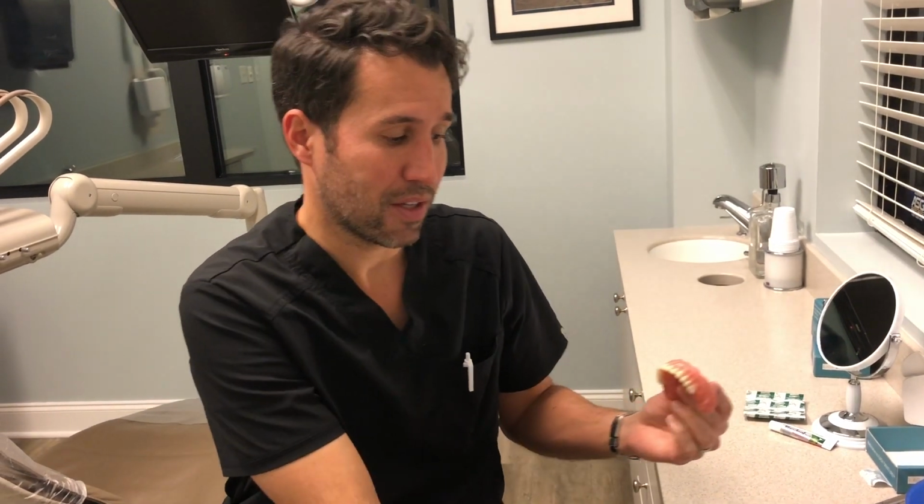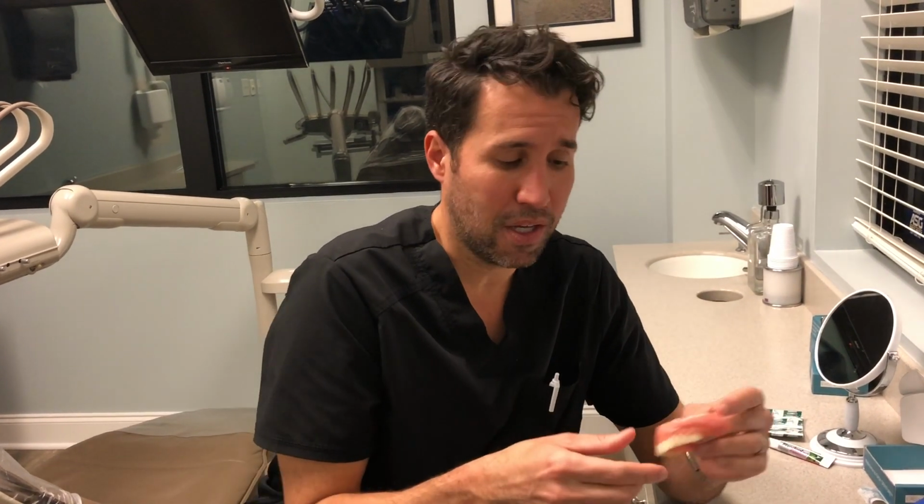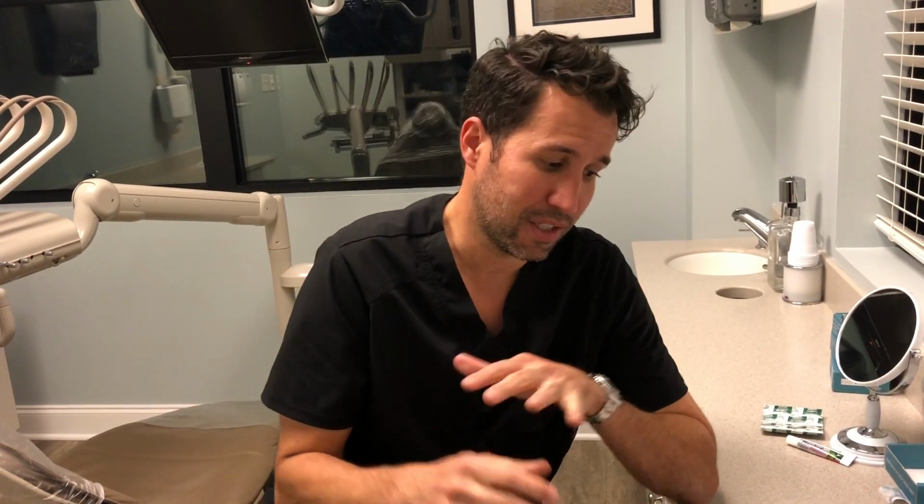Oftentimes I'll do this in my practice and have patients have these as a great backup. Or if they have a lab repair, it's just great to have in our practice as an immediate denture always, just for the patients. Like, look, we've got a nice low cost immediate denture. Once everything is healed up, then we can move forward with a nice high end cosmetic set. This is not to replace your high-end cosmetic set dentures.